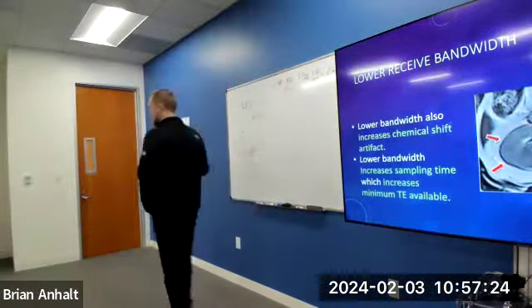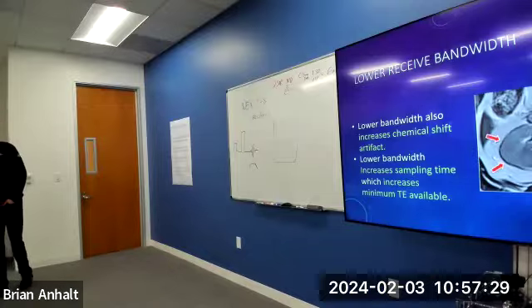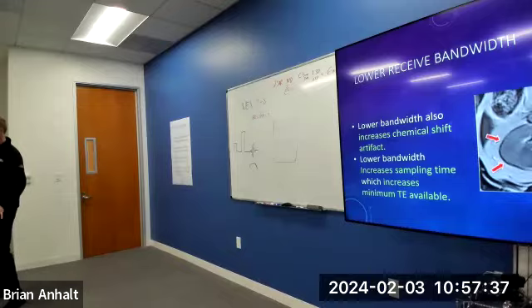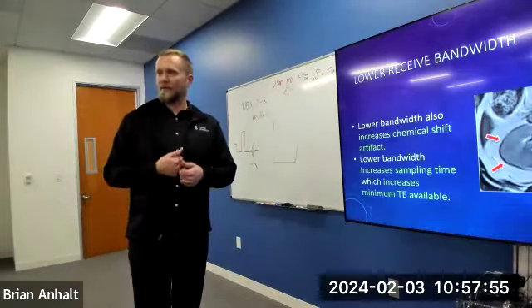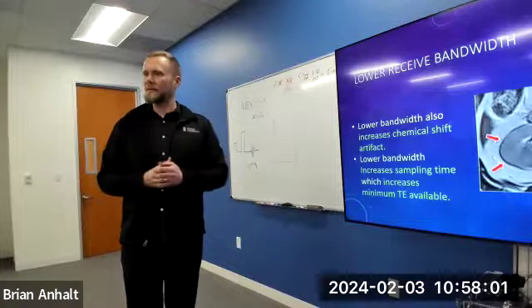You're going to have to know all of these trade-offs. What happens if I decrease my bandwidth, or what doesn't happen? So we all agree if we increase the bandwidth, that means that our gradient amplitude during the echo collection goes up, right? Creating a larger range of frequencies. What happens to my SNR? Goes down, right? Why does the SNR go down? The noise goes up, right? Sampling more noise gives us lower SNR. Because that is the denominator of this increasing, right?